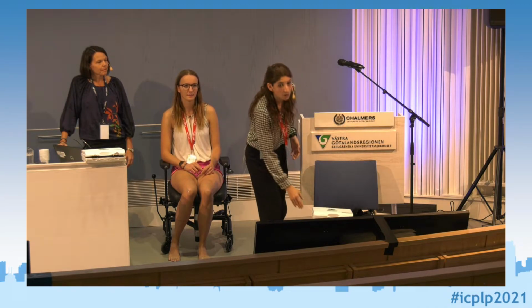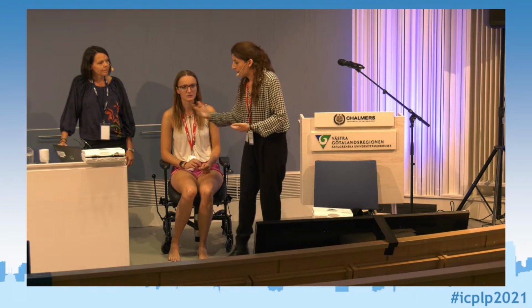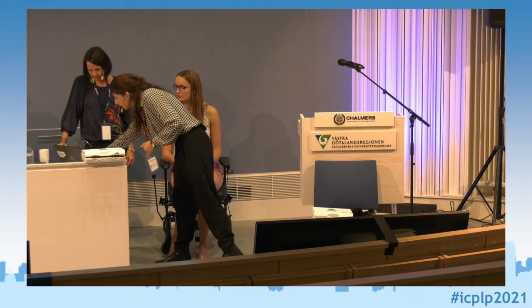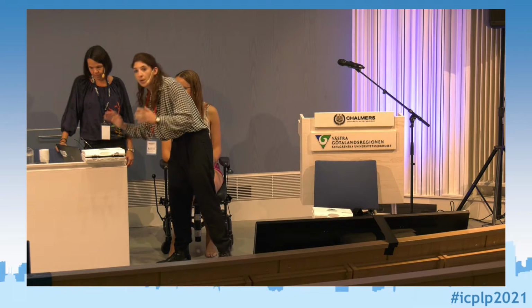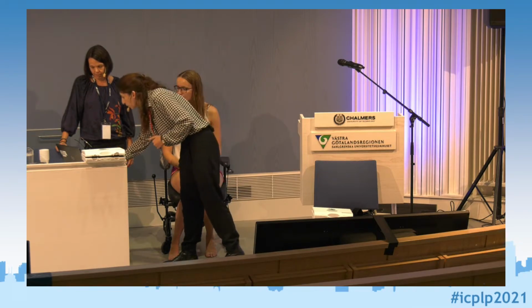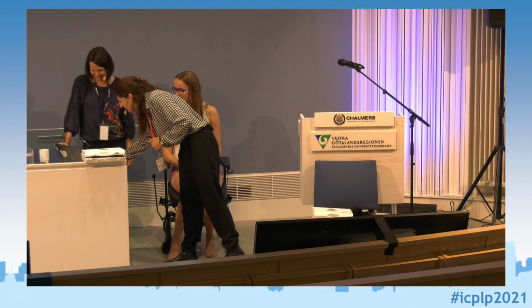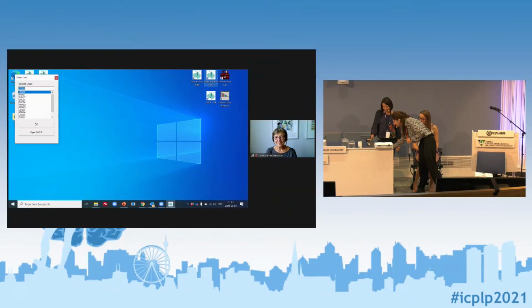So we are going to use their device and also their software. So now we are going to start first with our participant. I will show you on the computer how we start setting up. When you install the software, you can treat upper and lower limb. And at this moment, we are going to start with leg, of course, with leg.